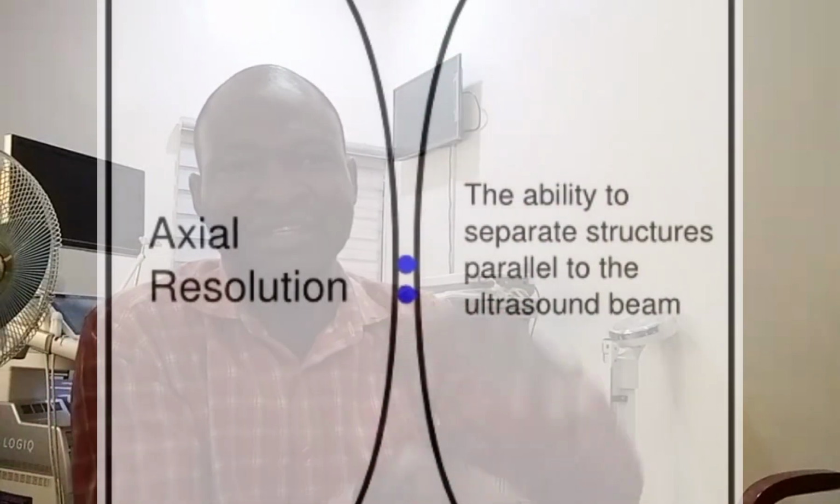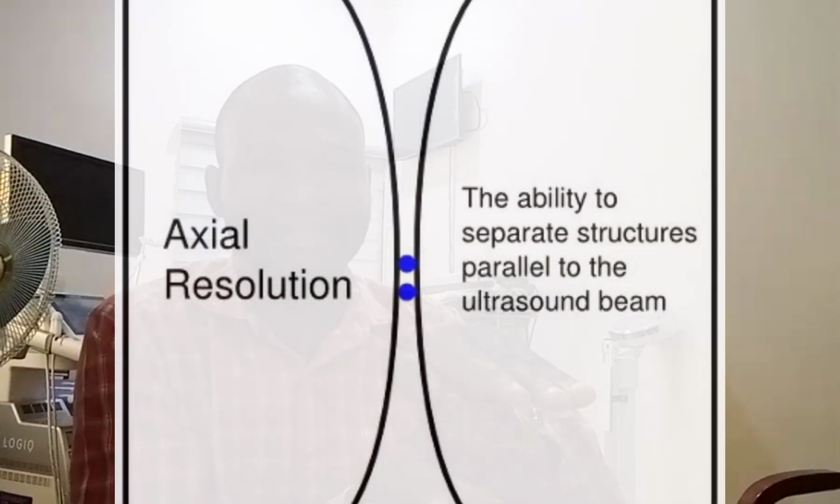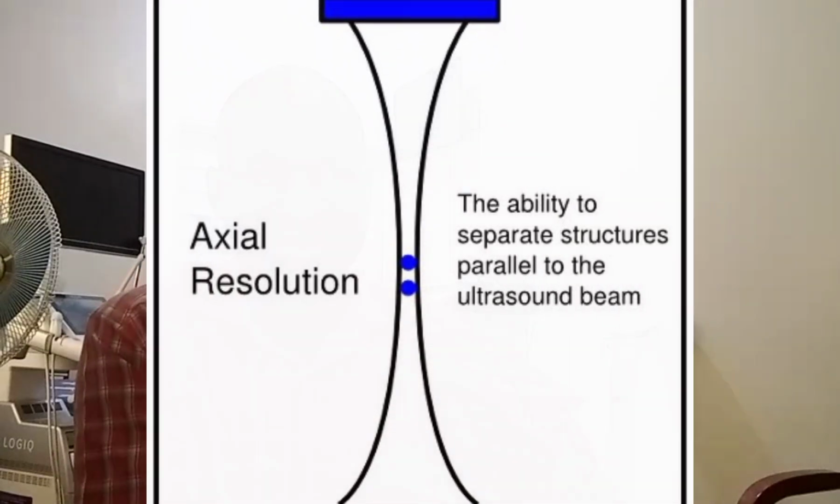Now, axial resolution is the ability to distinguish two structures or interfaces that are close together and lie along the beam's long axis, the path of the beam, one in front and the other behind. It is also called longitudinal, axial, radial, range, or depth resolution.